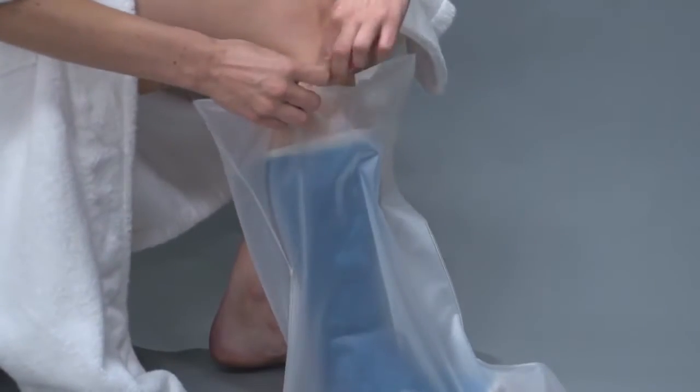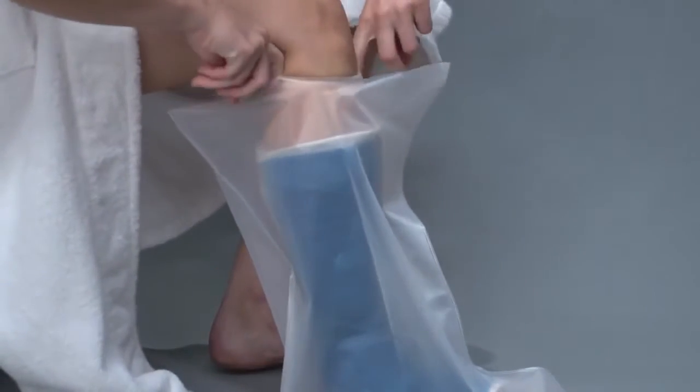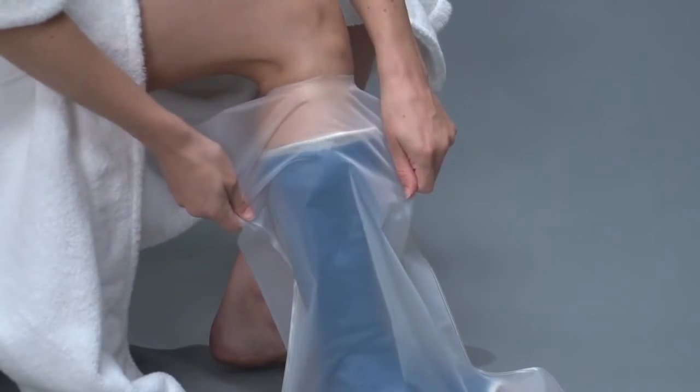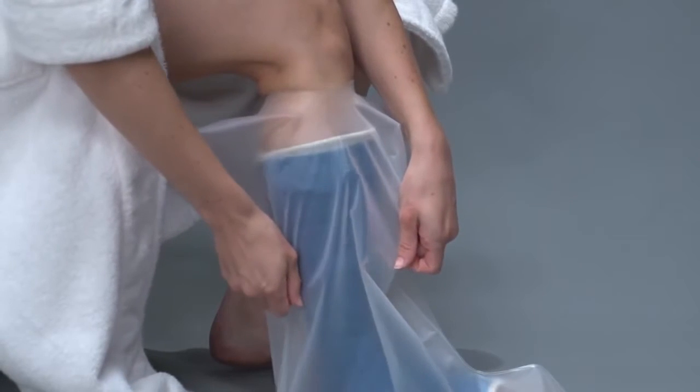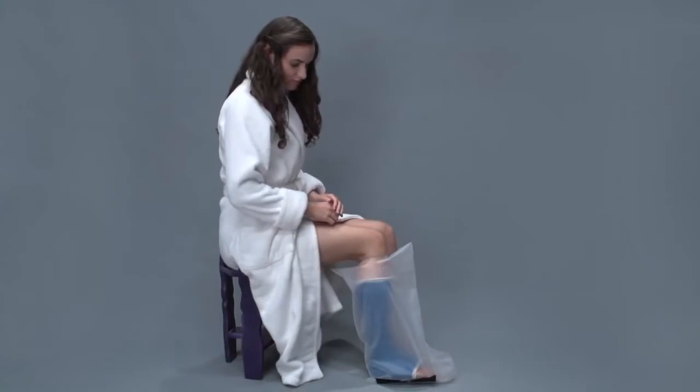Smoothing the seal area all the way around creates a plastic band that's visibly tight on your skin. Pull back down slightly to complete the seal. You are now ready to use AquaShield for a shower.